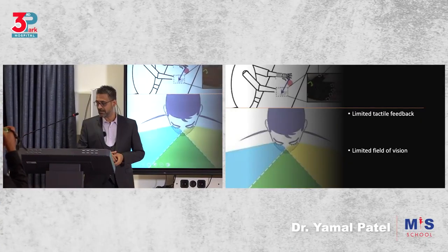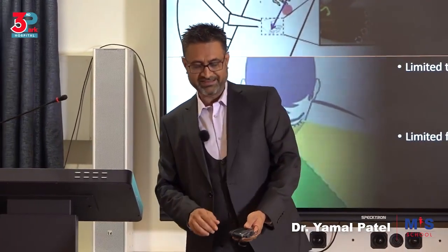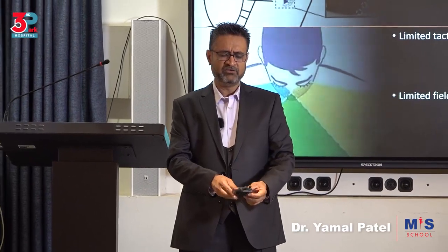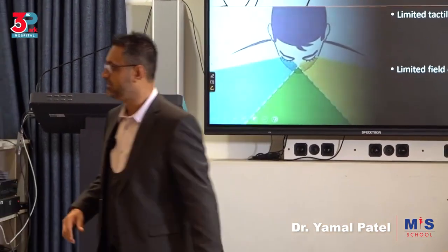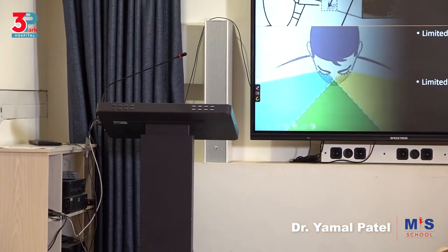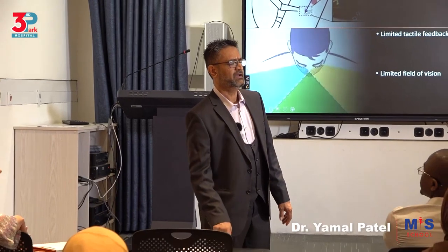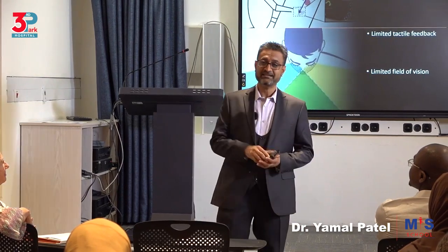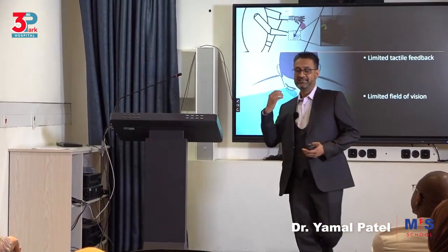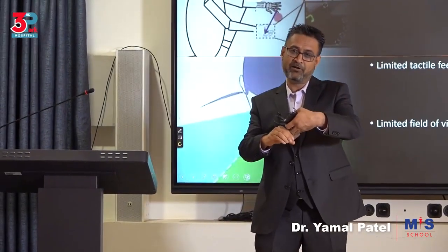Then limited tactile feedback. I tell people when we are training that if this thing was put on the table and I am supposed to close my eyes and just feel it this way, I don't need to be told what this is. I will still understand. Now, the same thing with the laparoscopic instrument. If I am taking an instrument and I'm going to be doing this, I don't care how experienced I am, I may not be able to tell you the exact consistency, how firm it is, what is the exact shape in there, especially if it's a fibroid inside in the myometrium.